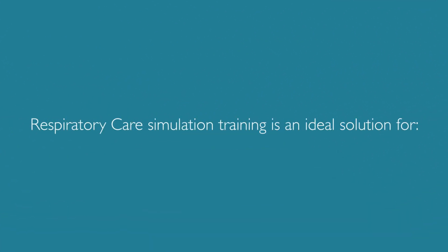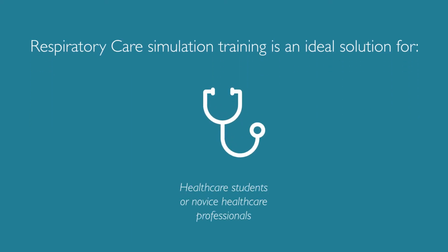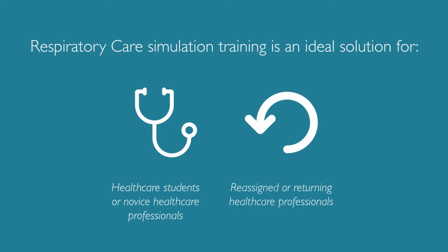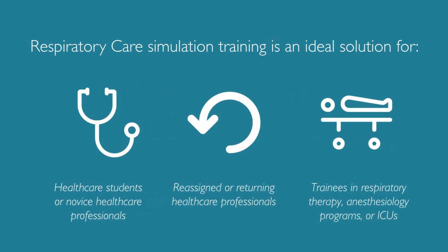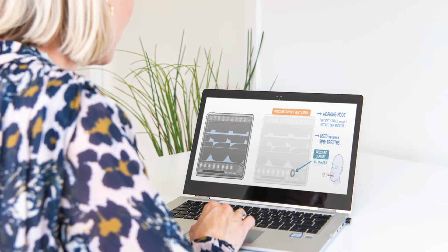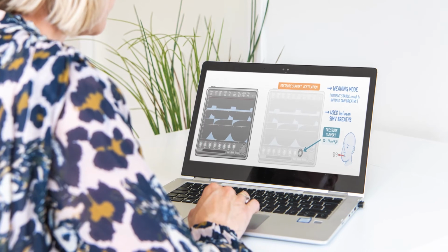Respiratory care simulation training is an ideal solution for healthcare students or novice healthcare professionals, reassigned or returning healthcare professionals, trainees in respiratory therapy, anesthesiology programs, or ICUs. This systematic step-by-step solution ensures competence and consistency for your learners and enables you to track progress along the way.